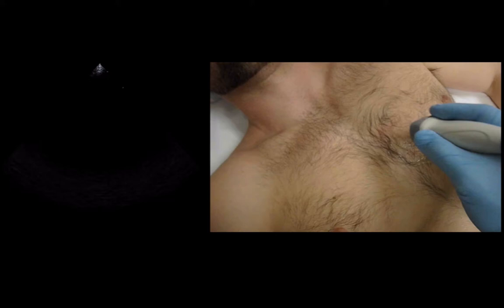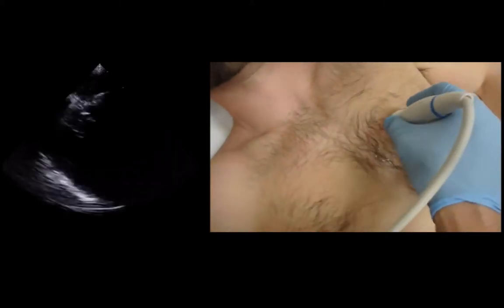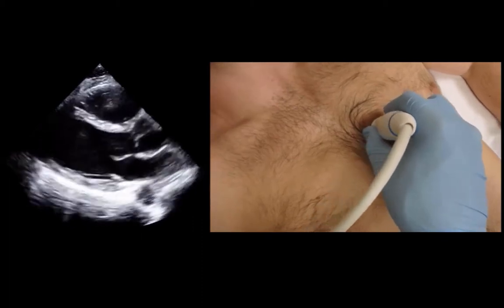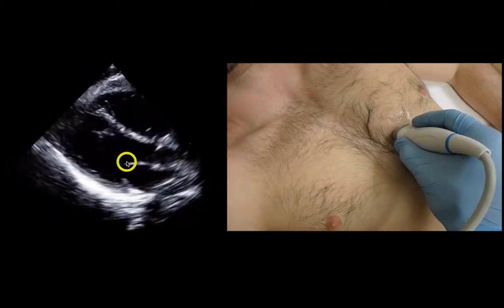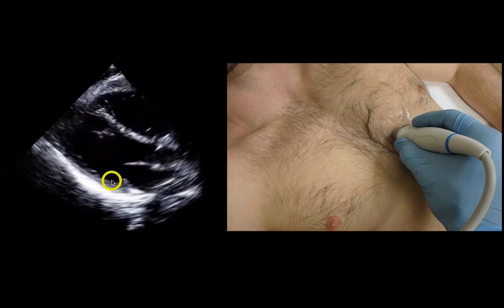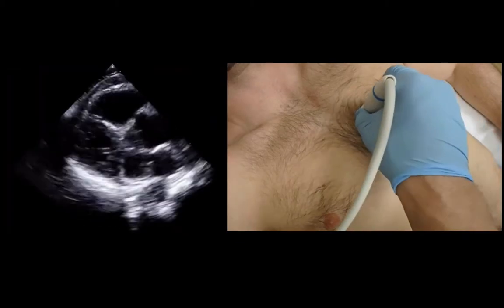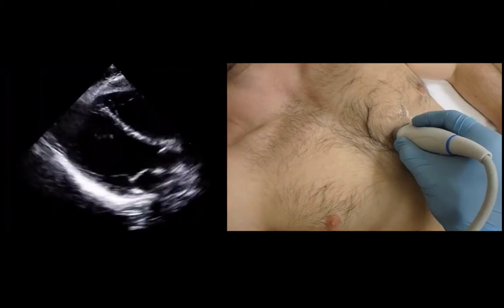Let's move on to the parasternal long axis view. When placing the probe, there's no set landmark I go for — I just take it where I think it should be and do these kind of circles until I find the image I want. You do a little tweaking and find that nice parasternal long axis view, where you can see the left atrium, mitral valve, left ventricle, aortic outflow tract, and right ventricular outflow tract. You need that ventricle to be more perpendicular to the beam. If the apex is tilted up toward the probe, you're too close to the apex — bring your probe up a couple of rib spaces and the left ventricle should flatten out into a more classic parasternal long axis.